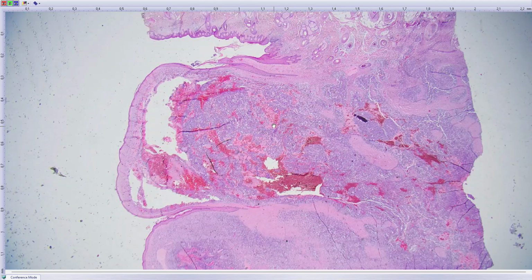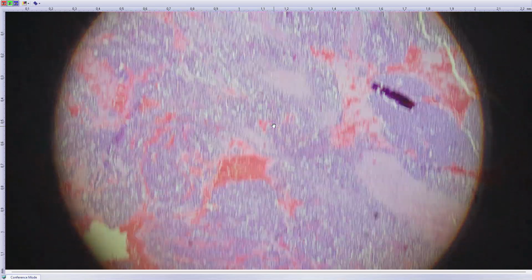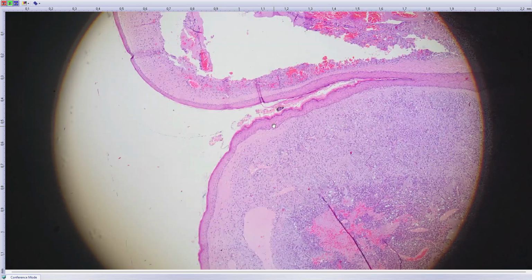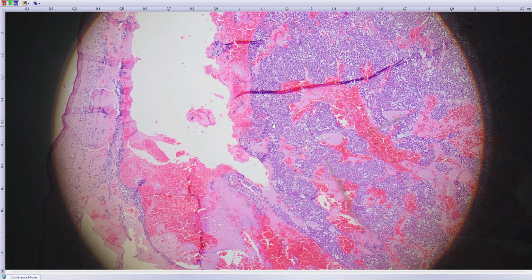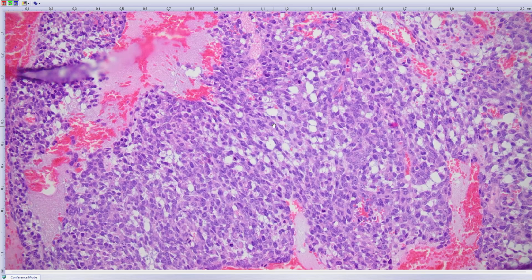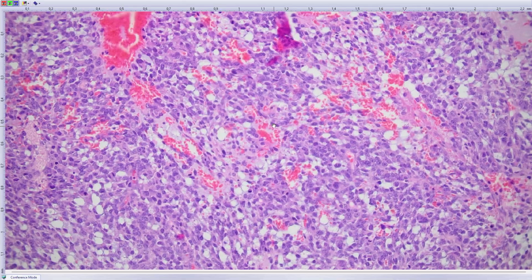in the skin. Already from this magnification, you may expect something aggressive because it is very cellular, very dark. The epidermis, I will not be going around, but there was nothing in the epidermis. But the tumor is kind of abutting the epidermis and looks aggressive, very cellular, quite atypical, still relatively monotonous, but the nuclei are hyperchromatic. There are innumerable mitoses, a lot of atypical mitoses.